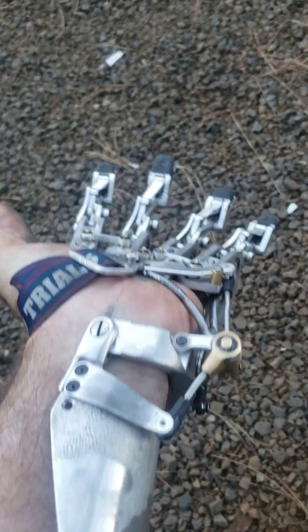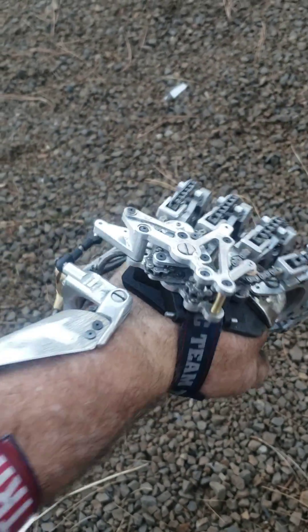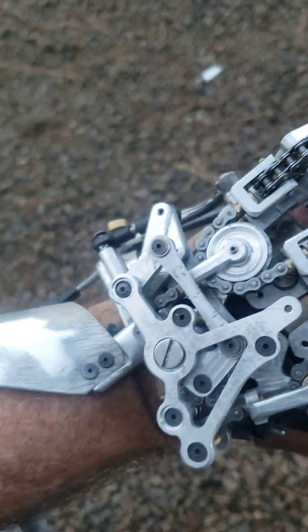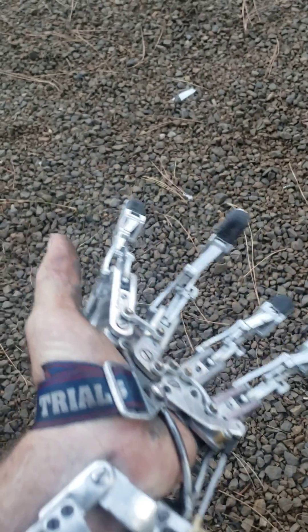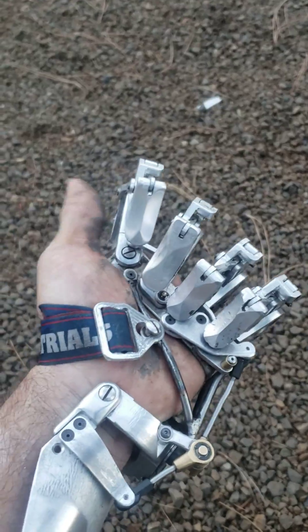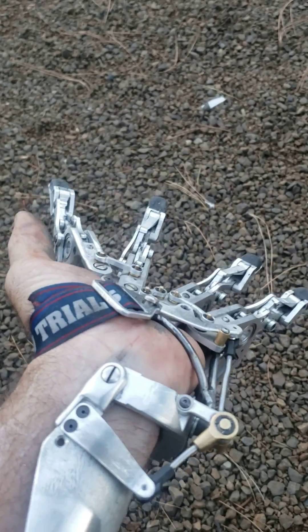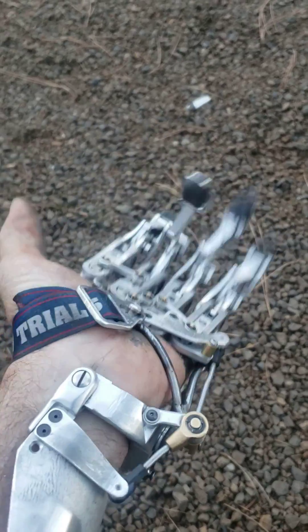Here it is — after a pile of design and redesign, this is my new hand. As you can see, I'm using a winder setup to pull the chains in order to operate the wiffle tree. The splay works nice.